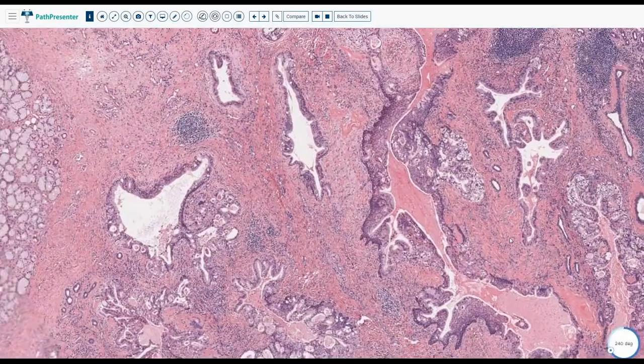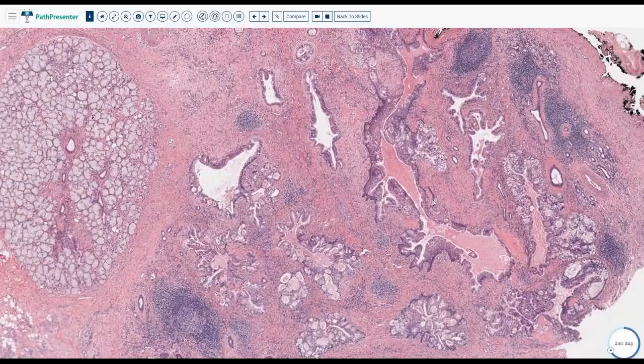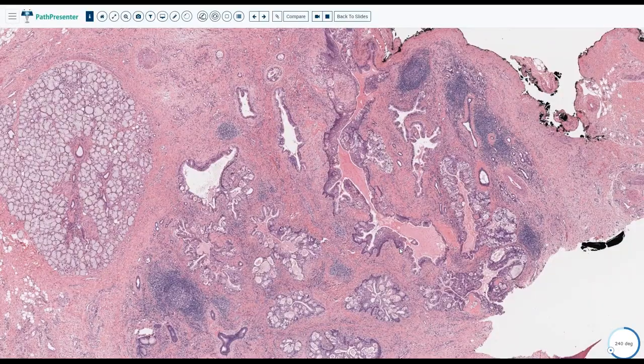All right, now we go to the grading. That is actually what the surgeon will be waiting to hear. All the fancy stuff that I've been talking about is nothing for them. We really need two things. The first thing is the grading. So anybody would like to grade it for me? All right, yeah, I agree with you. It is low grade. Based on what?